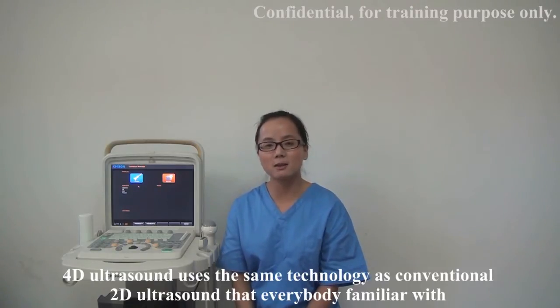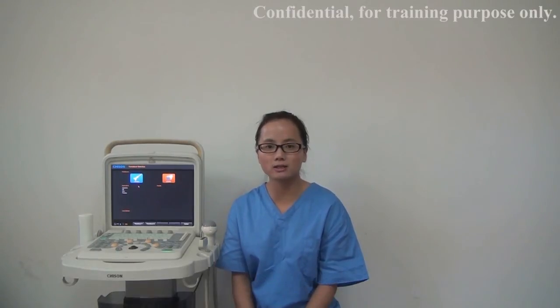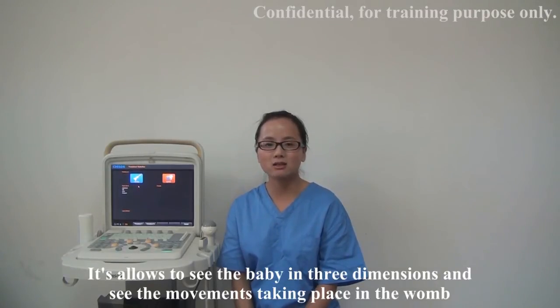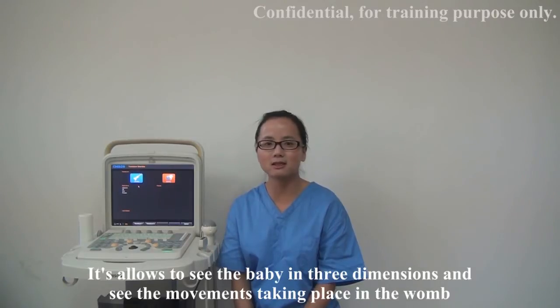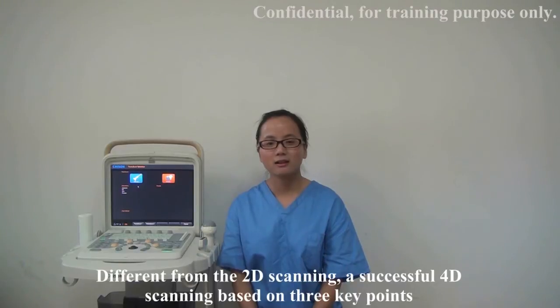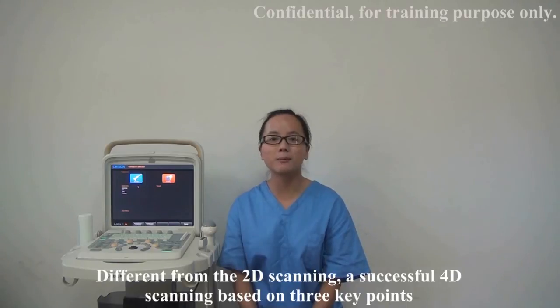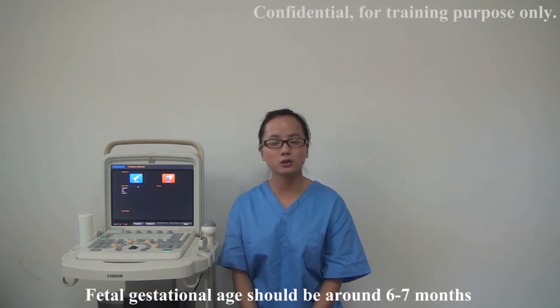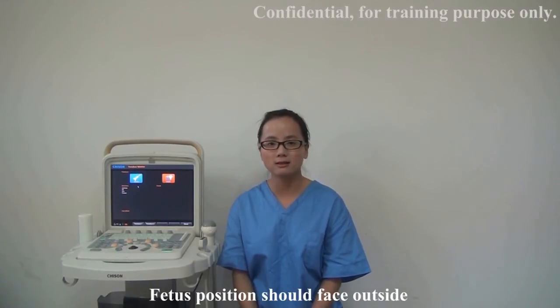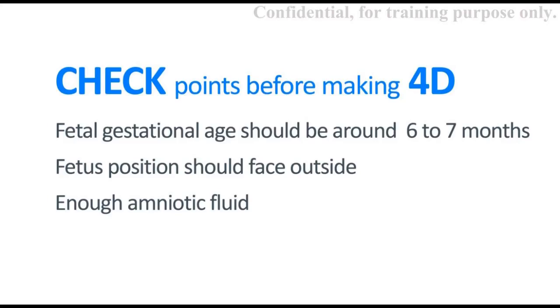4D ultrasound uses the same technology as the conventional 2D ultrasound that everybody is familiar with. It allows you to see the baby in three dimensions and see the movements taking place in the womb. Different from 2D scanning, a successful 4D scanning is based on three key points: fetal gestational age should be around 6-7 months, fetal position should face outside, and there should be enough amniotic fluid. Check the three key points here.